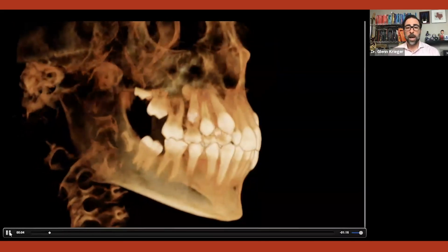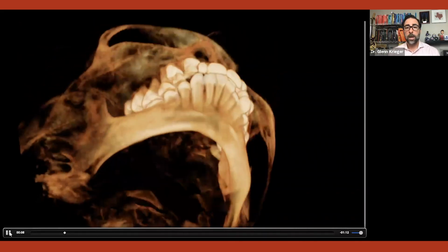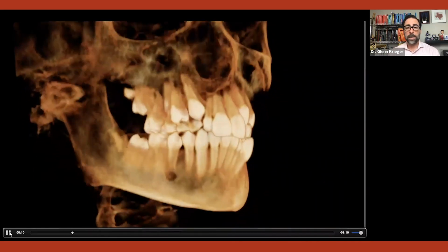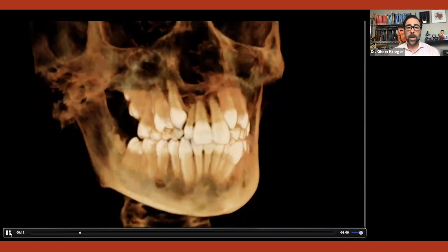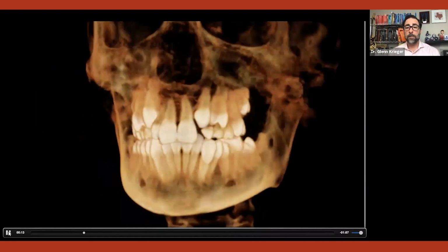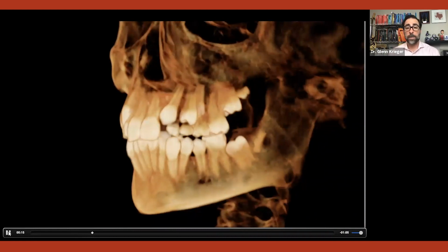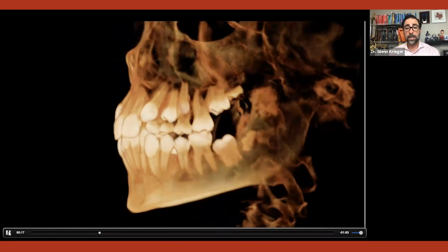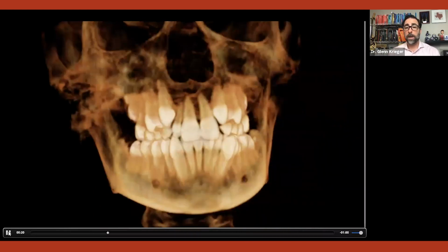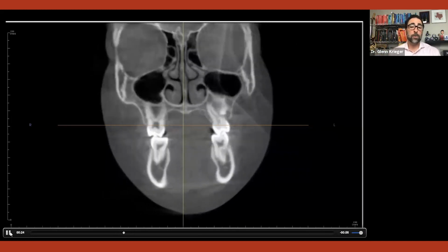So all of a sudden, I noticed that, if you take a look at that cuspid on the right side, where is it relative to the arch? I can see that it's a little bit buccal. I can see that my upper right second bicuspid is coming in palatally a little bit. If we look at the upper left cuspid, you can see where that's coming in. And again, you can see how your upper left second bicuspid is erupting to the palate slightly. And you can see the buccal root of that upper first primary molar, second primary molar is not being resorbed.